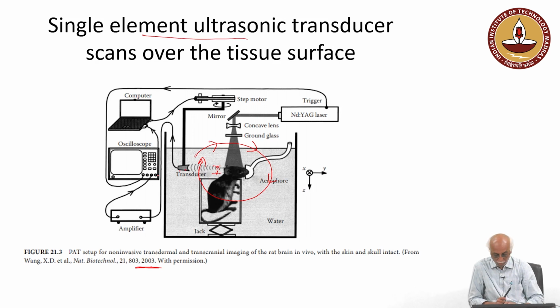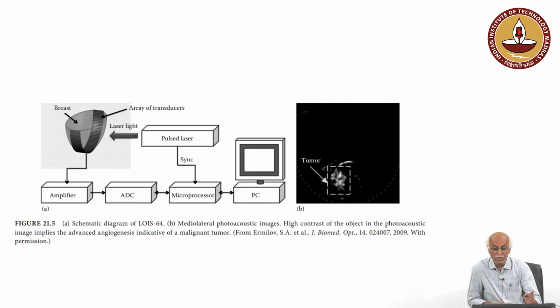It is also possible to capture the signal using an array of transducers. So, what are we observing? We can observe if there is any tumor in this tissue.